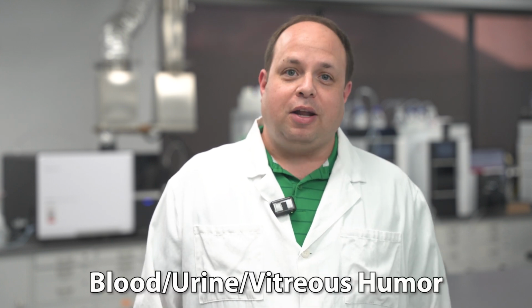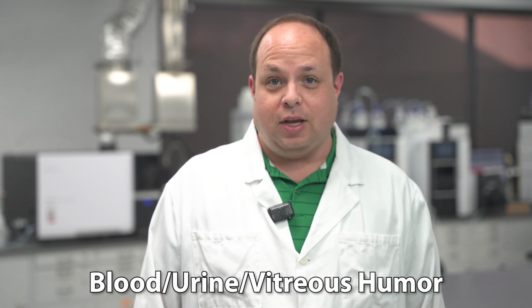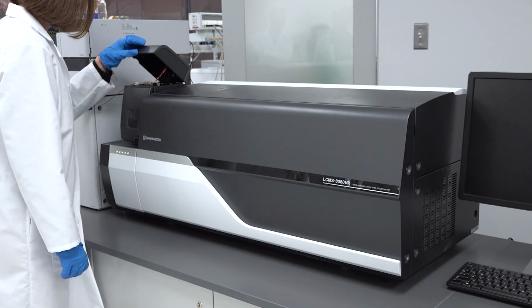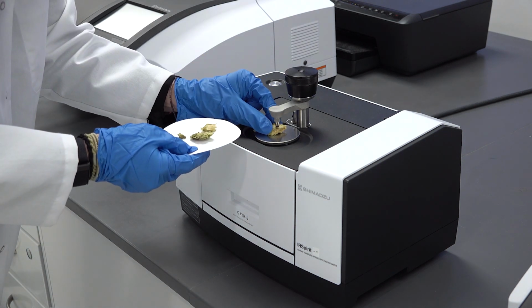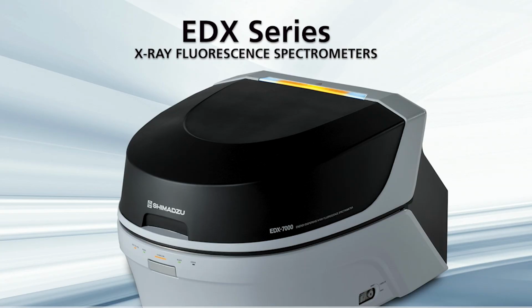When analyzing bodily fluids such as blood, urine, or even vitreous humor from a crime scene, more sensitive analytical instrumentation may be needed. Liquid chromatography mass spectrometry is a tool which can analyze drugs or toxins in biological matrices in femtomole ranges. Trace evidence materials such as hairs, fibers, gunshot residue, films, and adhesives can be identified using FTIR as well as other instruments such as EDX.